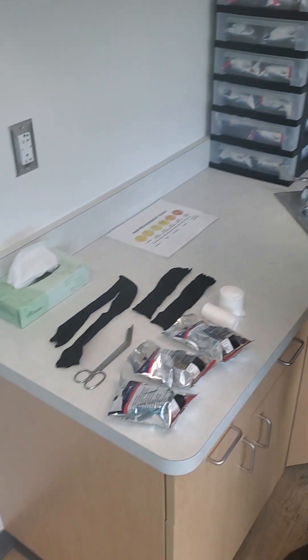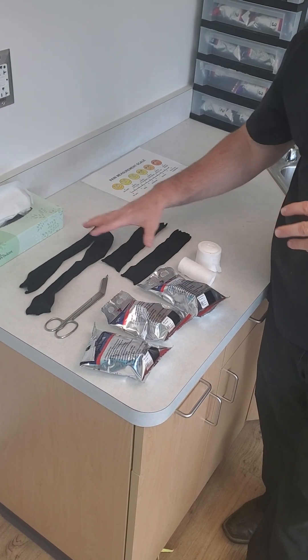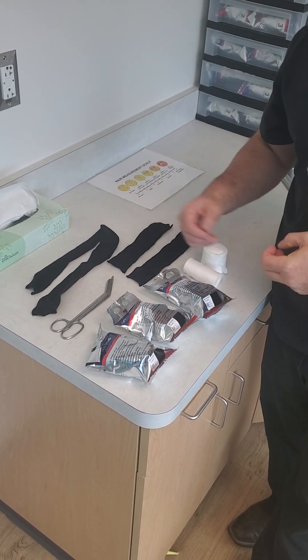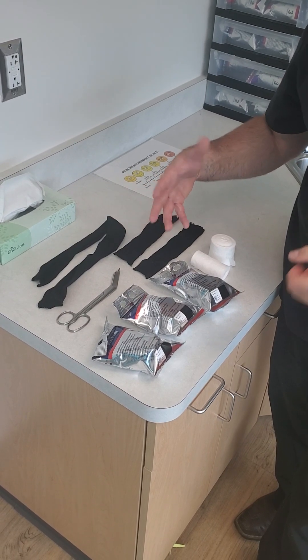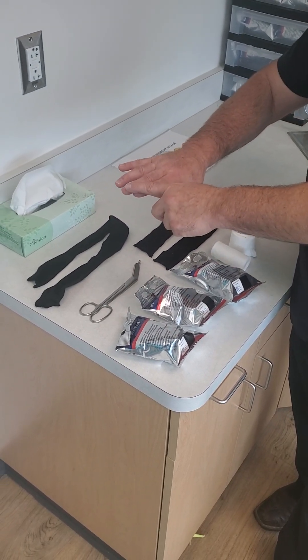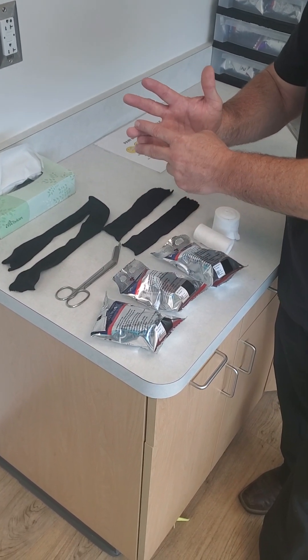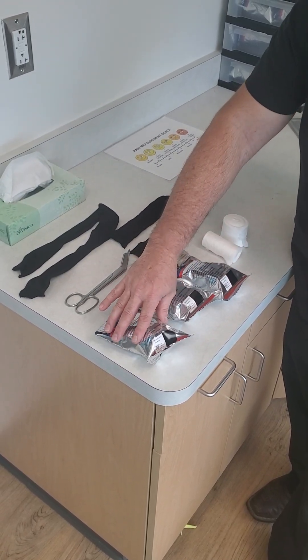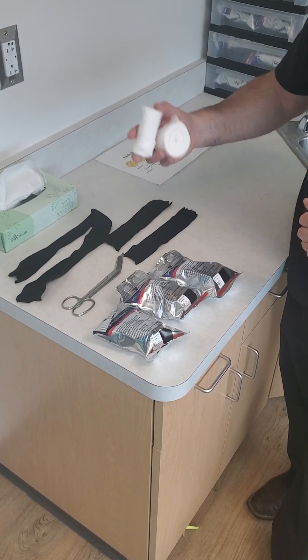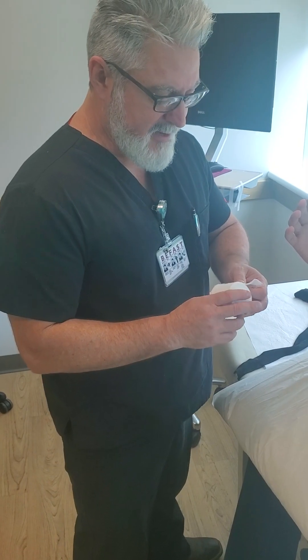I've already laid out what you'll need: three strips — and again this is just one version, there are other ways of doing it, but this is the way I favor. There's one long stockinette for the fingers, hand, and arm, and two shorter ones for the two fingers not involved and the thumb. I've brought out three packages of cast tape, though I think I'll only use two, plus some padding and bandage scissors.